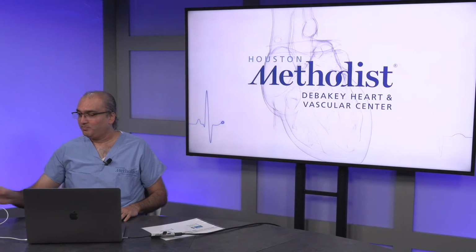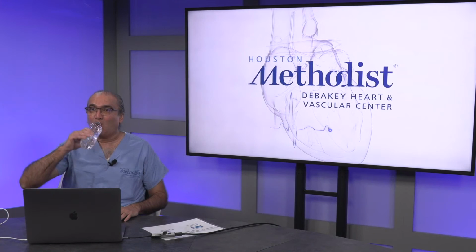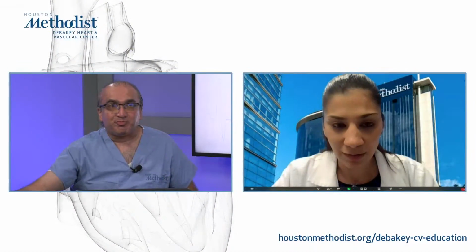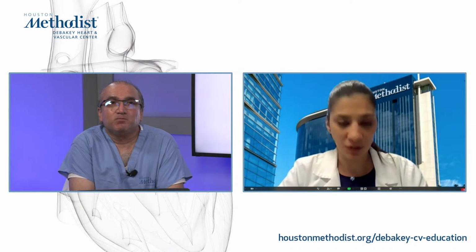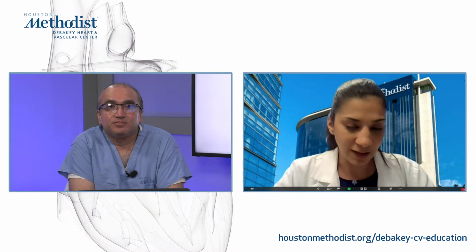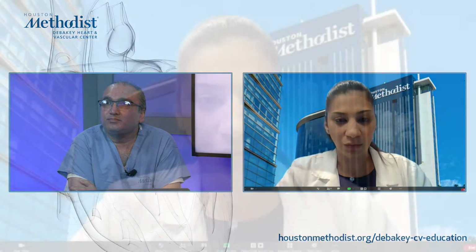Thank you, Dr. Shah. So yes, we see a lot of TAVR patients, and some of them have mild aortic regurgitation. I would refer back to the guidelines for the assessment of regurgitation after transcatheter interventions. It has very nice figures and images to show you how you can quantify that lesion accurately, because that's the first thing you want to do. Most of the time, if it's mild, then we just watch it. Patients usually get a 30-day echo post-TAVR and a 1-year echo, and usually these lesions don't change.